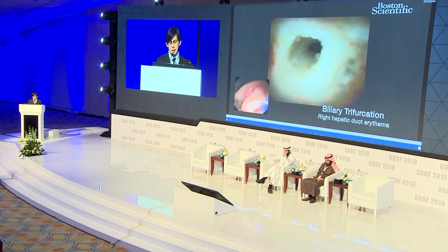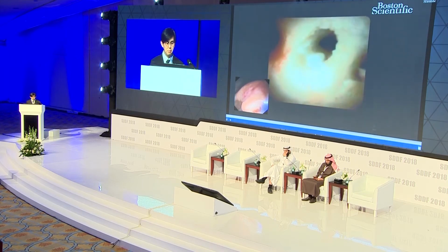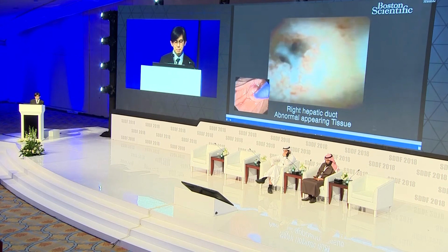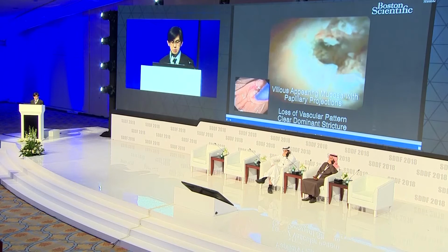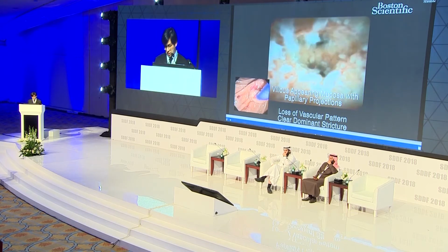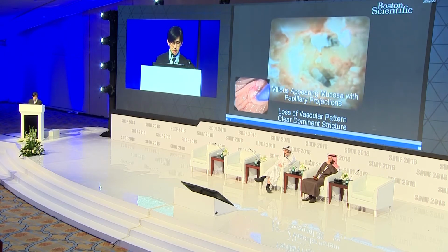This is not my video, but amongst the Caucasians, instead of pyogenic cholangitis, you see primary sclerosing cholangitis, and often you see intrahepatic duct strictures. Again, this device is useful for evaluation of strictures and for possible biopsy or tissue sampling before hepatic resections. And again, this was proven to be benign lesions.